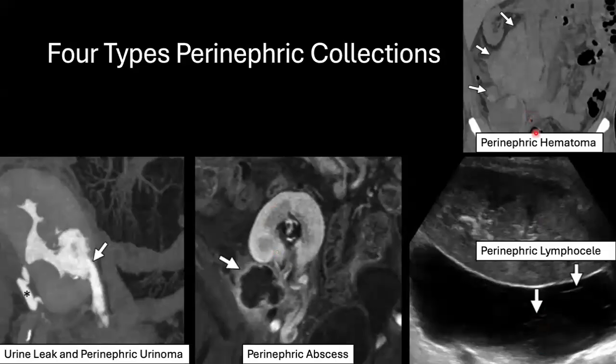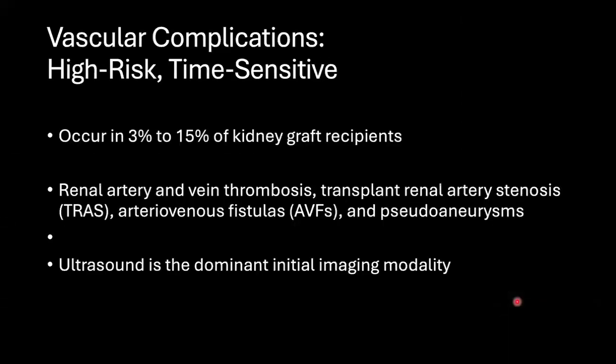And again, timeline would be important. Clinical presentation would be important. This patient would be febrile. This patient wouldn't be febrile. So all would be part of a greater workup for the patient.